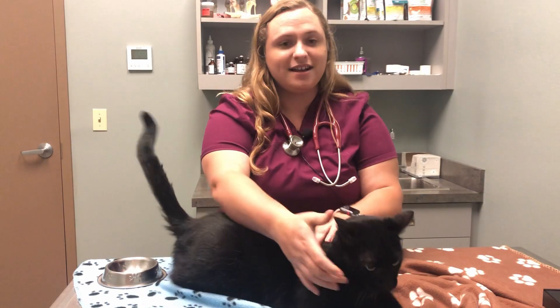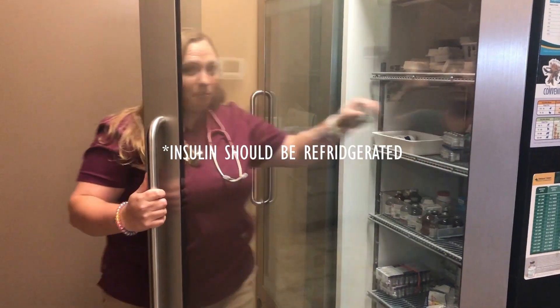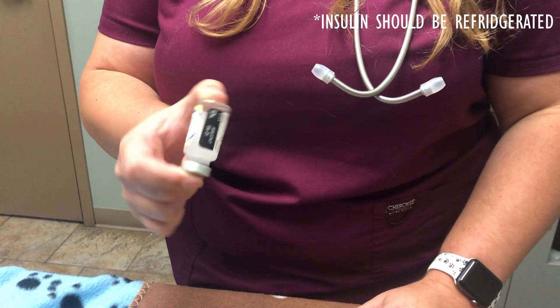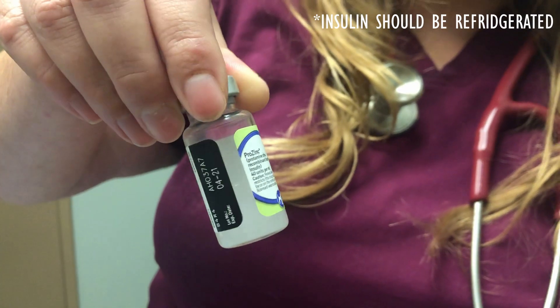If he has not, he does not get his insulin injection. I will begin by taking the insulin out of the refrigerator. At this point I will invert it very gently or roll it between my fingers to make sure to disperse the sediment so that it's mixed thoroughly.